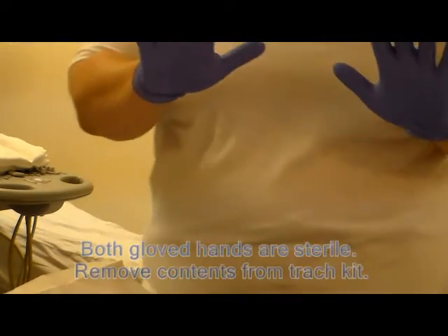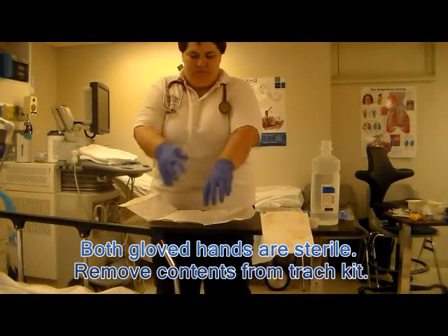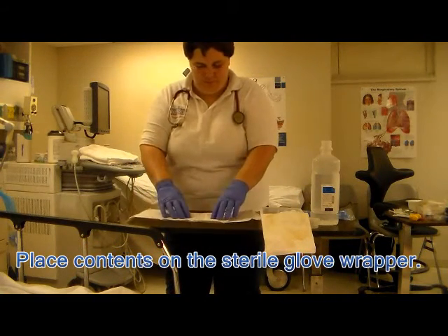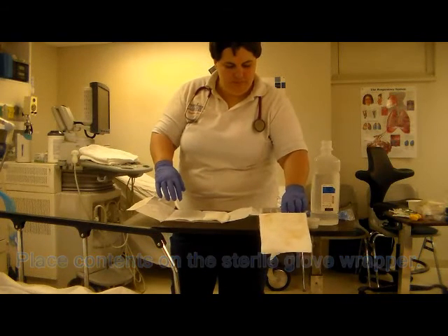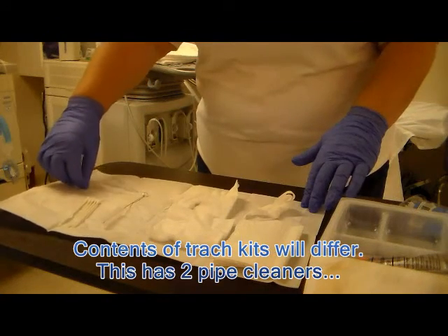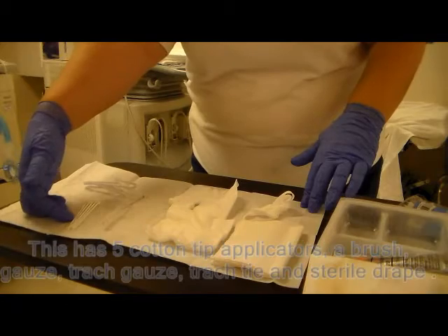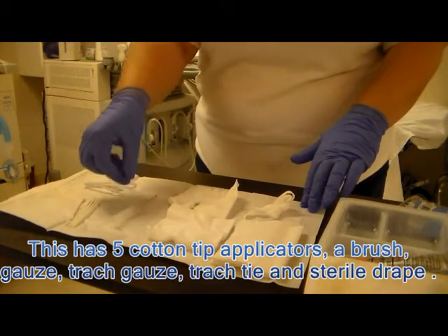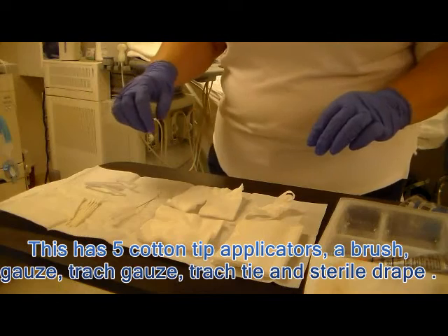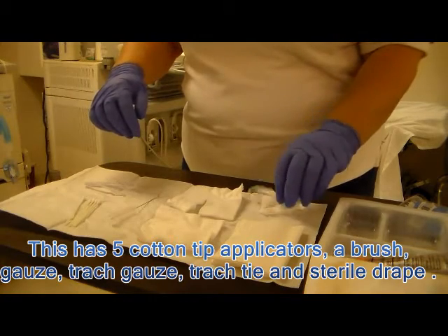With both hands now sterile, you're able to remove all of the items in your tray and place them right in the center of your sterile field. In this case you'll find two pipe cleaners and in this kit five q-tips, a brush, a gauze, and a trach gauze — the one that's split — as well as trach ties and a sterile barrier.